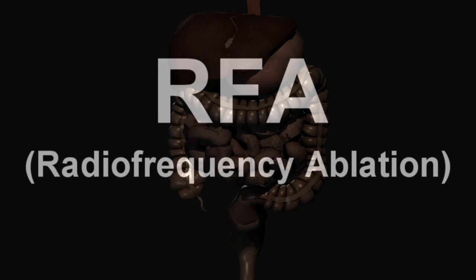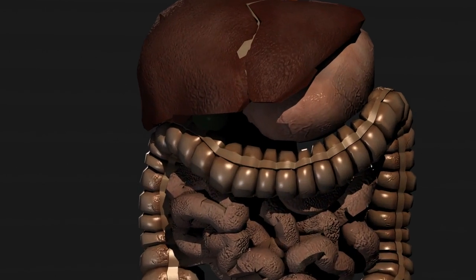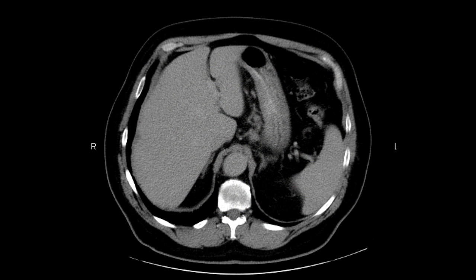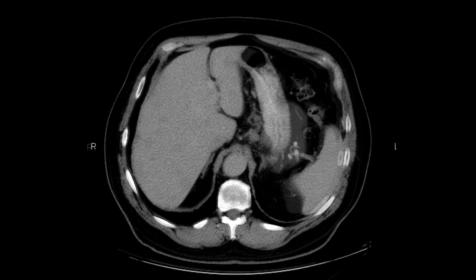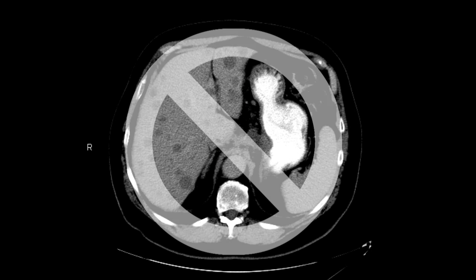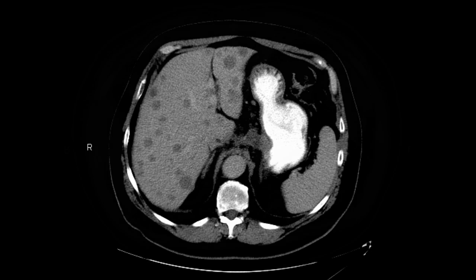Radio frequency ablation is a technique we can use to treat isolated tumors in the body. By isolated, I mean one or two lesions without extensive metastatic disease. For instance, this patient who a few years ago had a normal looking liver — homogeneous density, no nodules or abnormal masses — but a follow-up scan a few years later shows extensive metastatic disease everywhere. Each low-density gray lesion in the liver is a metastatic focus. This is not a good appearance for radio frequency ablation; there are too many lesions to treat with this technique.